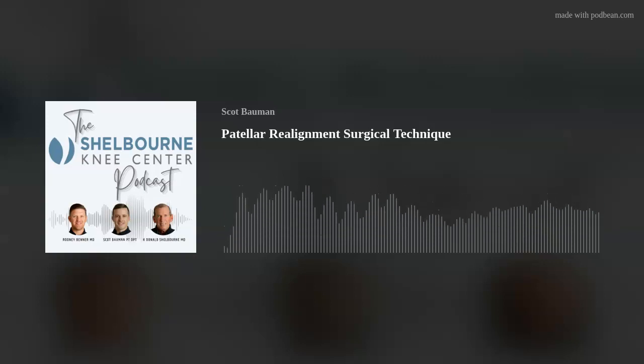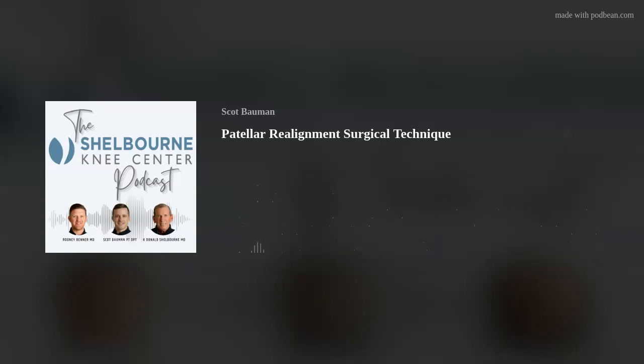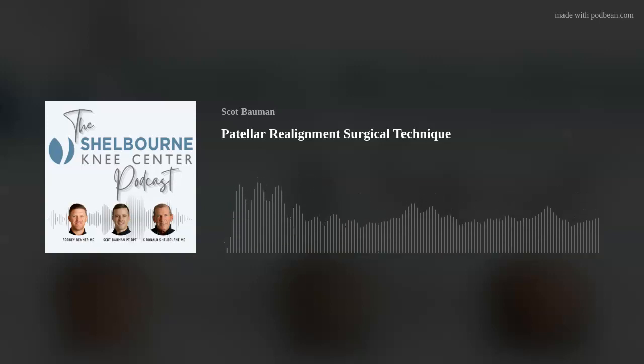One thing that I have had good luck with recently is using lag screw technique. I used to just do the osteotomy, push the tubercle piece at the top medially, and then fix it with the plate at that point. With just position screws, just drilling the screws and putting them in as position screws. Over time, I started to think I wasn't getting good enough compression, so I started drilling those with lag technique and overdrilling the proximal cortex. And by doing that, I was able to get better compression across the fracture site, and I was happy with that. But I didn't think I'd really notice that much of a difference.